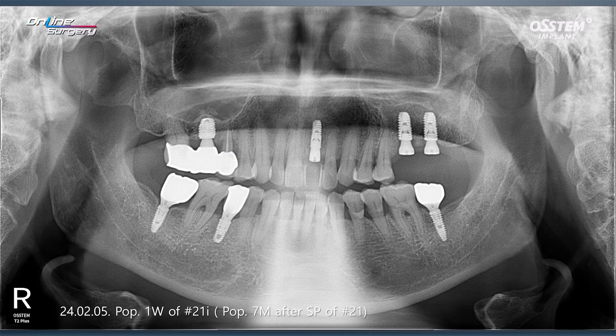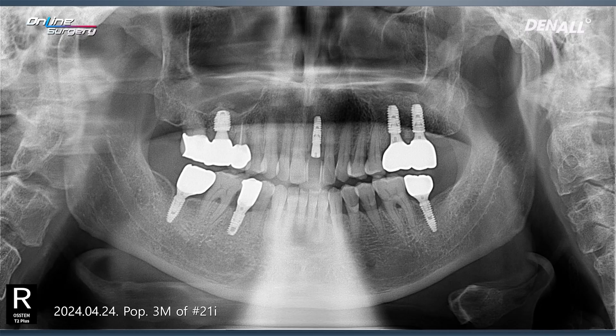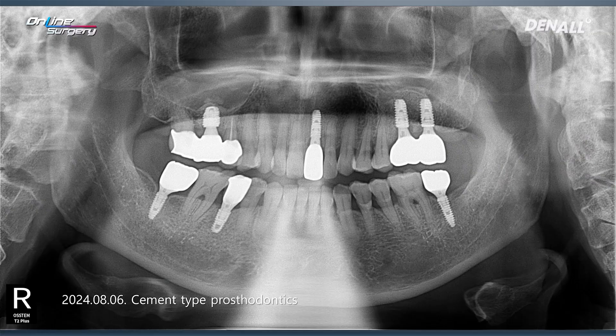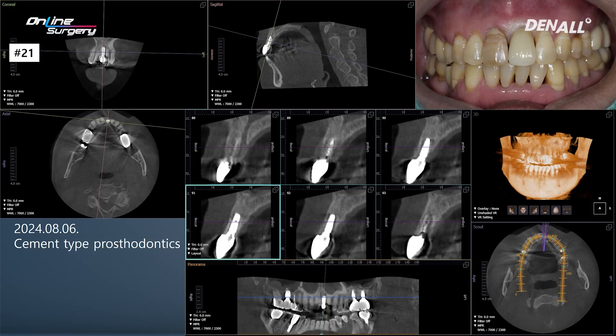The image shows the condition one week after surgery and nearly seven months after socket preservation. This next image shows the condition three months after the implant placement. After three months, the labial bone has been well maintained. The final prosthesis has now been seated. Even after seating the final prosthesis, the labial bone around the implant has been well preserved.